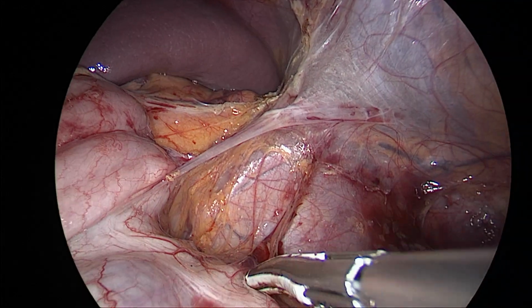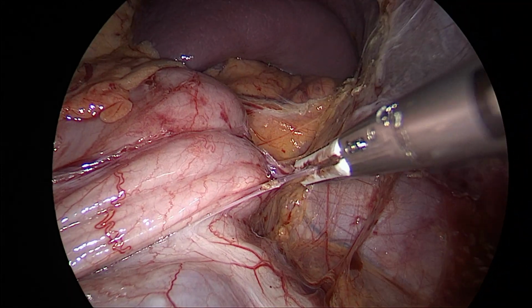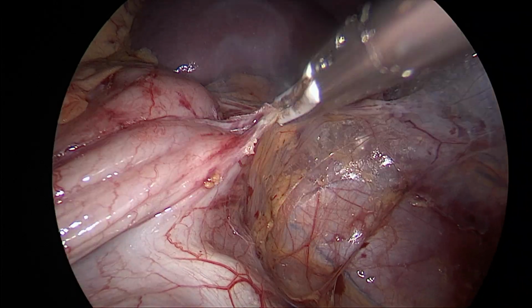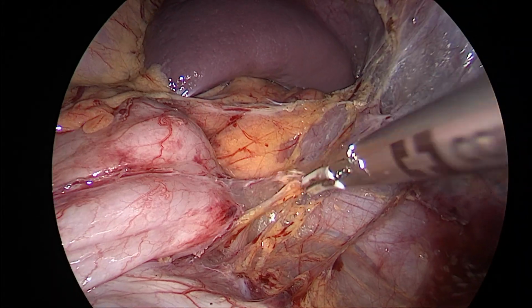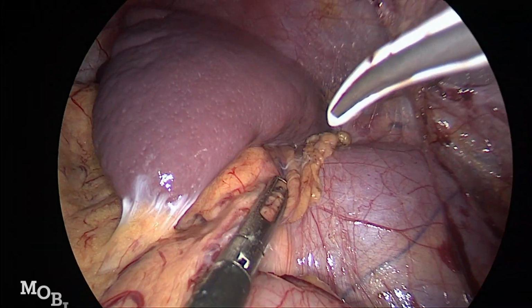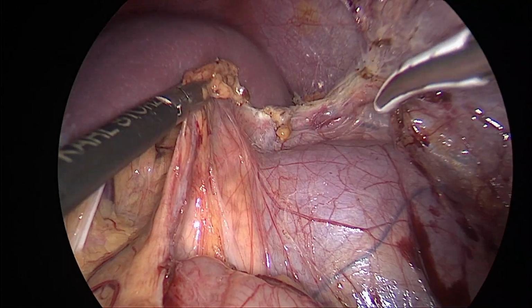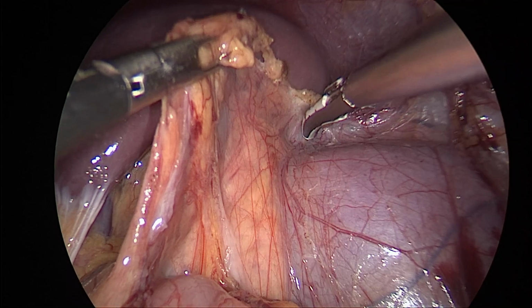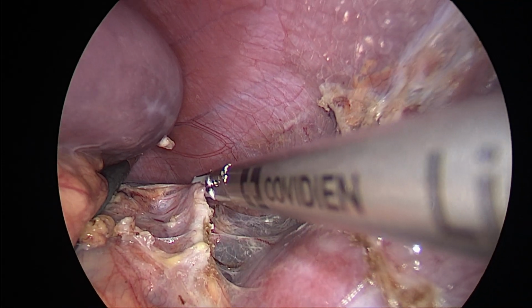Mobilization of the left colonic flexure is essential to gain access to the spleen. Especially in obese patients, extended mobilization of the descending colon is recommended to facilitate medial folding of the colonic flexure. Gently lifting the pancreatic tail aside, stepwise dissection of the splenorenal ligament proceeding all the way to the diaphragm led to greater mobility of the spleen.